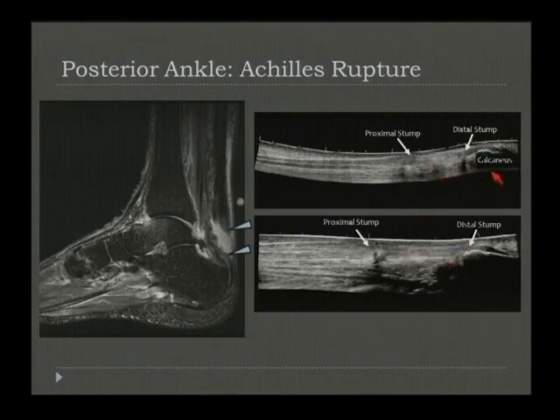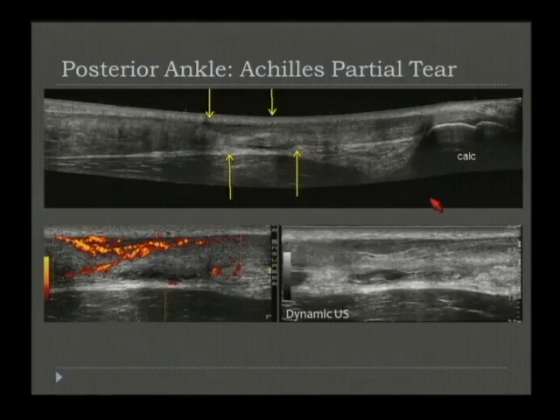I will show you kind of a finding that I thought was interesting, has been described in the literature. Typically, the distal stump will have a more anterior orientation, sort of flop down. It's been described, and I've seen it multiple times. If these two tendons were opposed to each other and you saw this course without it being a straight course, that almost always is seen in the setting of a full thickness Achilles tear and is a good secondary sign. This one obviously was pretty easy to diagnose given the retraction of these stumps. What do you do in a case like this?